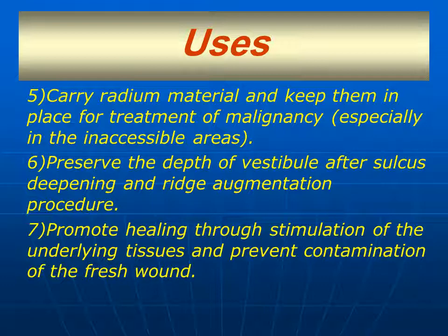Also, they preserve the depth of the vestibule after sulcus deepening and ridge augmentation procedures. Promote healing through stimulation of the underlying tissues and prevent contamination of the fresh wound.